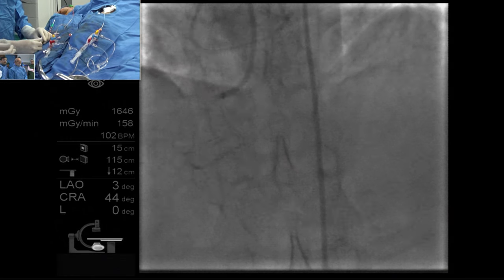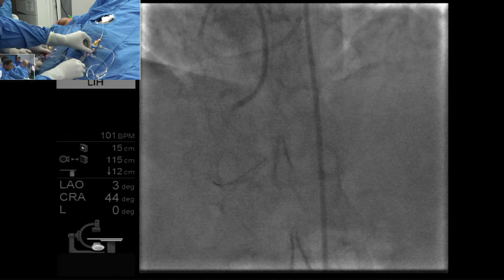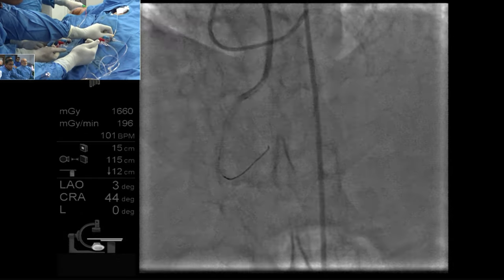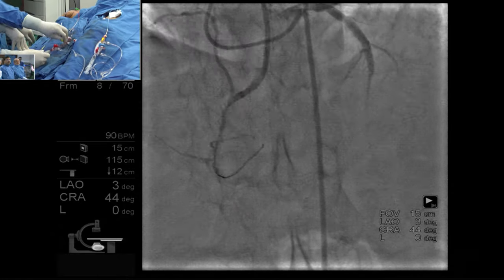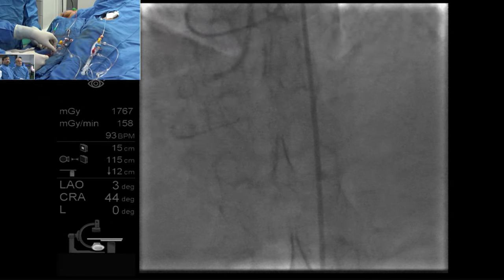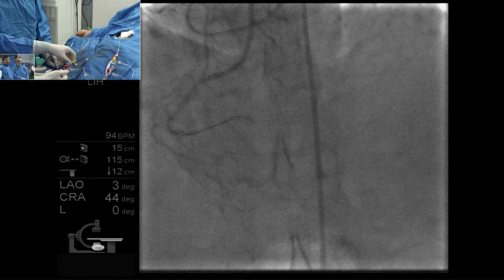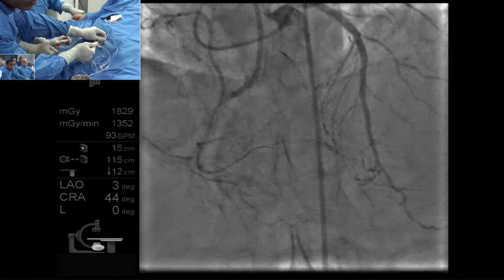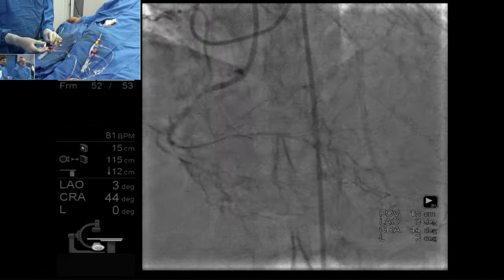Going somewhere. Do you want to take an injection? Maybe a small branch, or a subintimal. Oh, we are almost there, huh? This is in. You want to check it again? Yes, great. Sir, you have entered into the distal RCA. Let us see the PDA. No. False lumen. But it could be a small branch. Most likely it is a small branch.